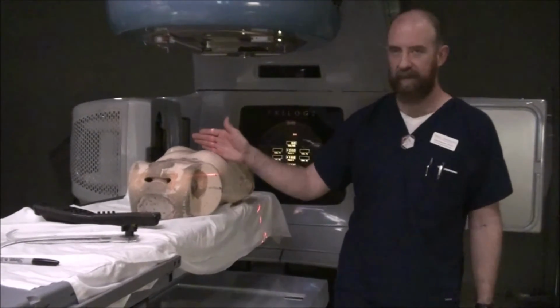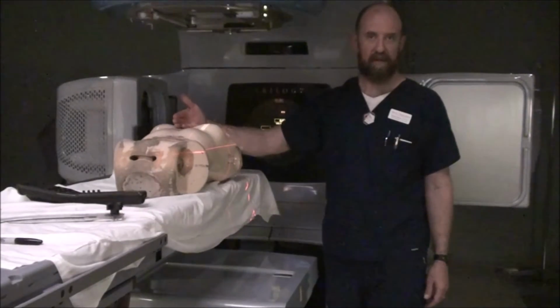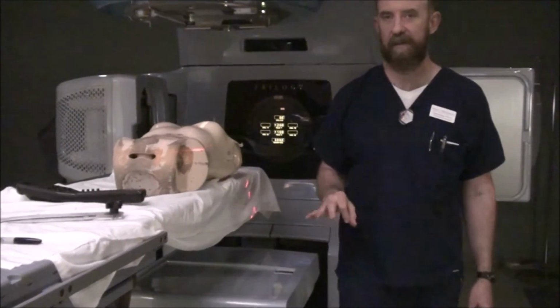Sternoclavicular, flash inferior, flash anteriorly, entry point posteromedially, I should say. Those are the big things to take away.